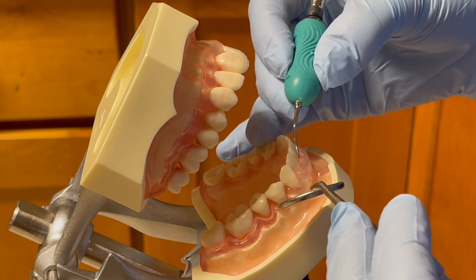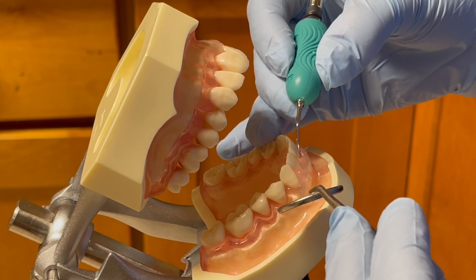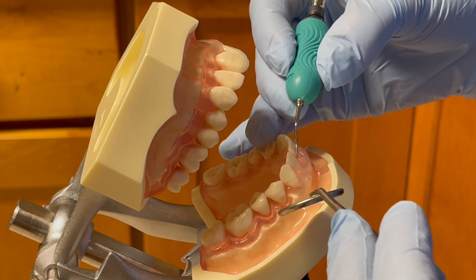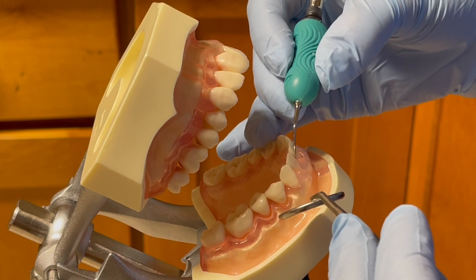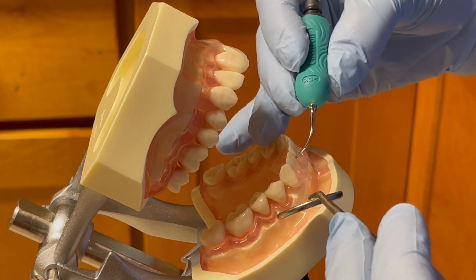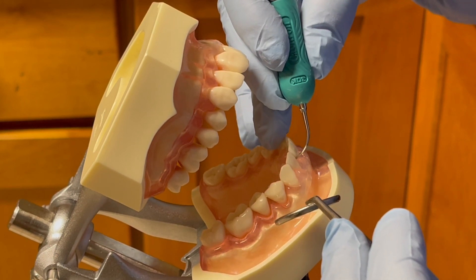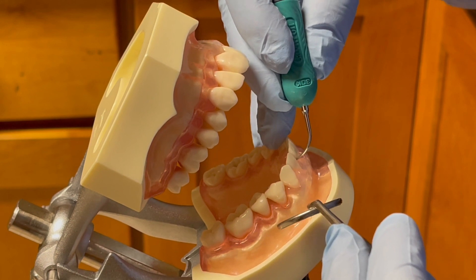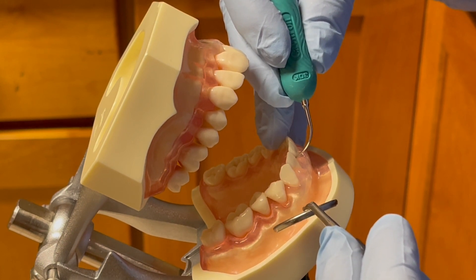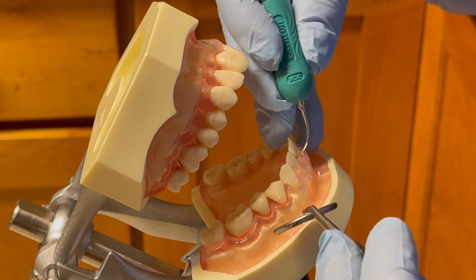I activate the USS using constant, well-controlled small 1 to 2 mm overlapping strokes, moving from the top to the bottom, covering all surfaces of the root in a systematic manner. I work the tip all the way from the midline to the distal interproximal. When touching the contact area, I drop my handle, use the face of the tip adapted to the tooth, and use vertical strokes. Then I stand my hand up tall with transverse orientation, use the side of the tip adapted to the tooth, continue using vertical strokes, and finish the distal interproximal surface.